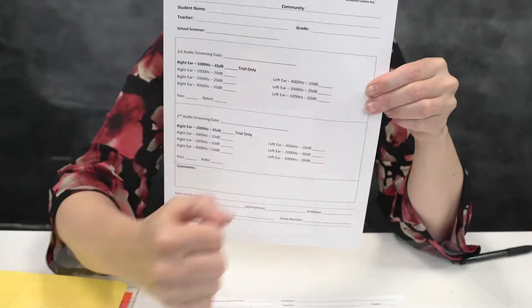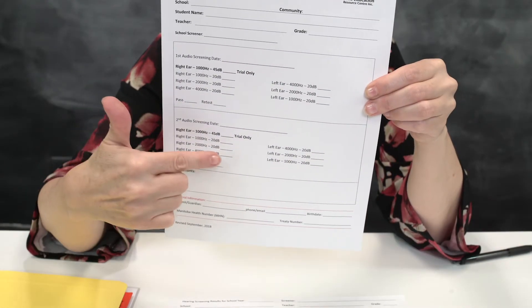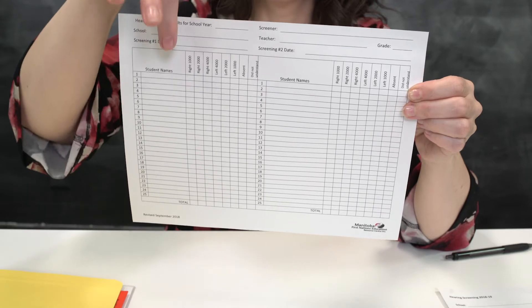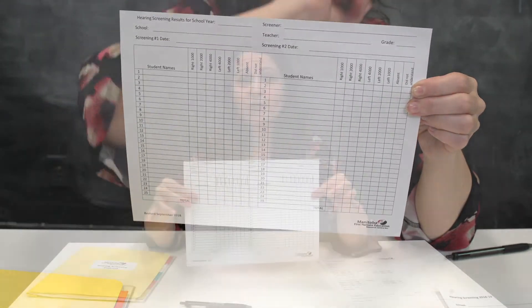That's where the bottom portion of their page comes in. You put in the date. You put in the check marks for every spot that they heard. If they did not hear in one spot, you put an X. If there is even one X, you're going to check off refer. You're going to take this information, transfer it back over to this sheet. This sheet you're going to fax to us, plus a referral form so that we can make sure that these students get a full diagnostic assessment.